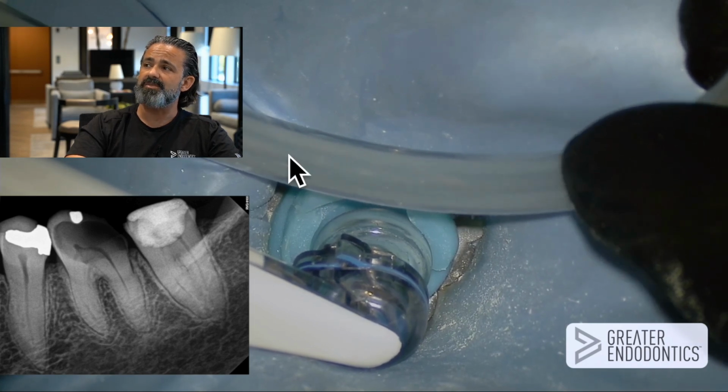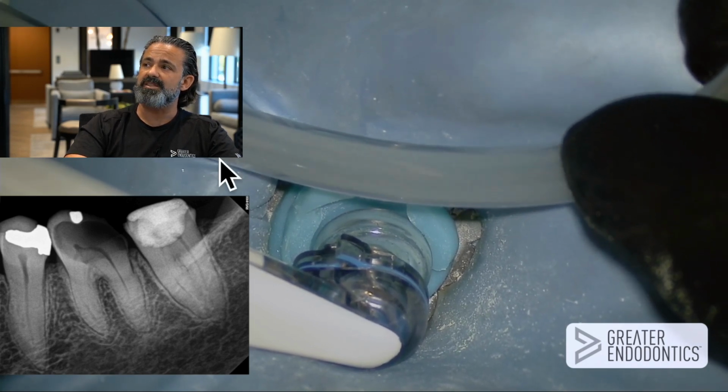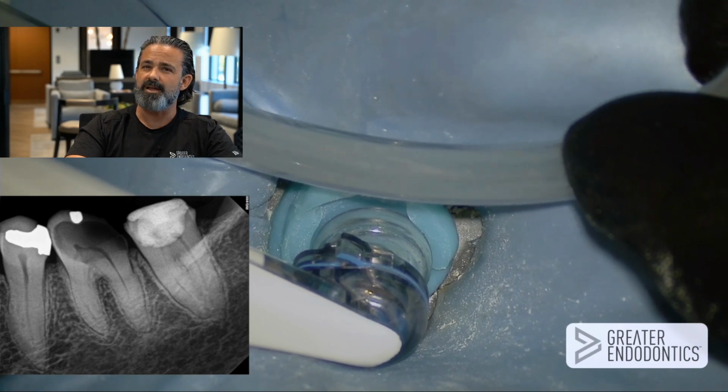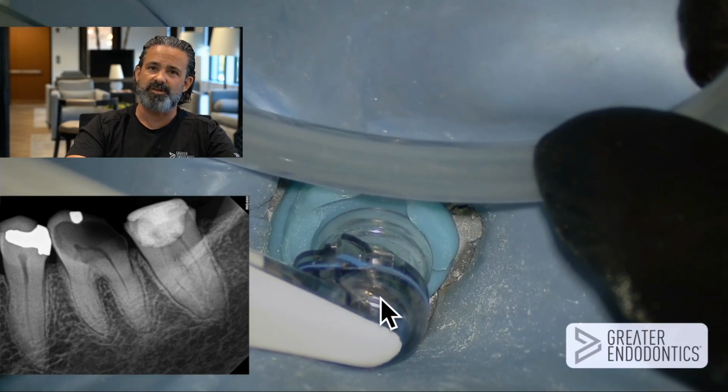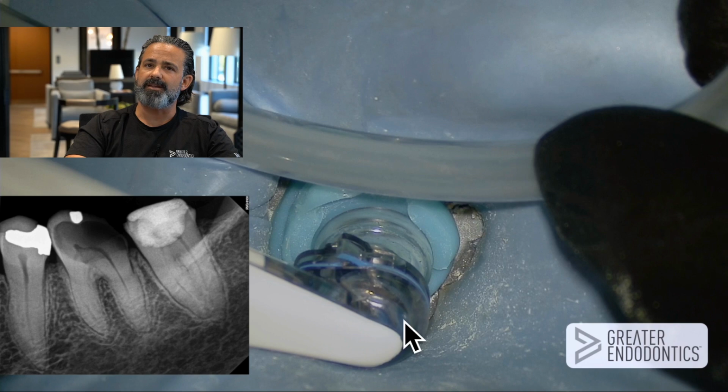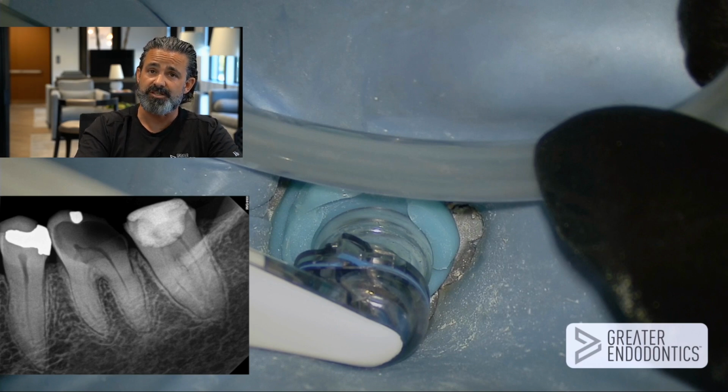And I'm watching what comes out. Now, sometimes these pulsations that come out through the exhaust tube are hard to identify, and it's kind of a pain in the butt to hold it up here. So I usually just look through the window of the procedural instrument. And a lot of times what I'm looking for is those bubbles, but I'm also looking for red, because that will also tell me that I'm getting patent or established openings into that extraradicular space. And I want to know when that occurs, because there could be a time in a case where you abort. You stop what you're doing if you think that's excessive, and you should stop if you think that's excessive. Safety first, always safety first for the patient.